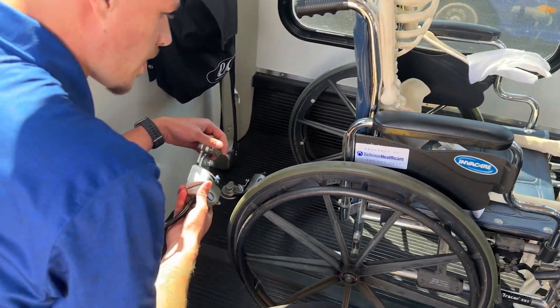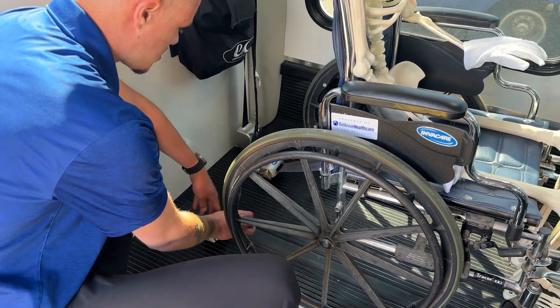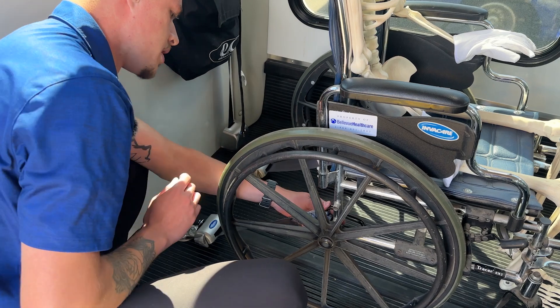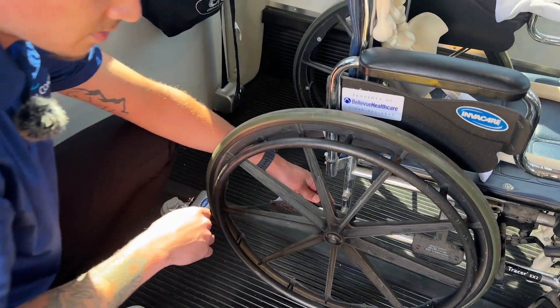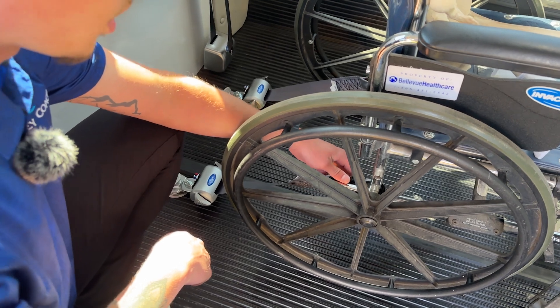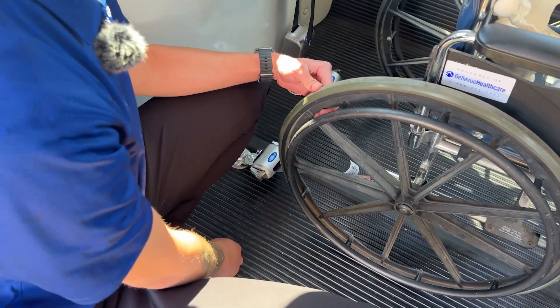We'll do the same thing for the right side rear. Go ahead and secure our slide and click, then press the red lever and attach hooking from the inside again on that 90-degree welded member of the wheelchair. We'll snug that up and we're good for the rear.